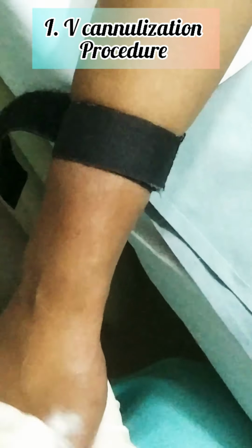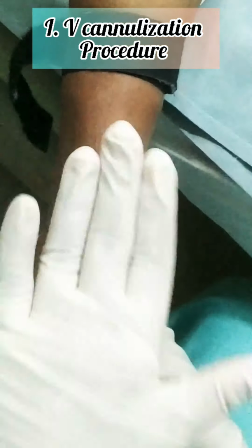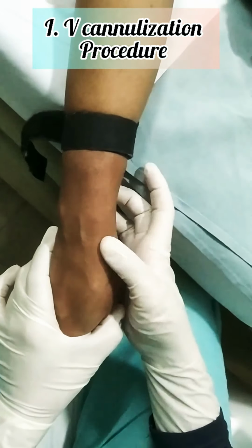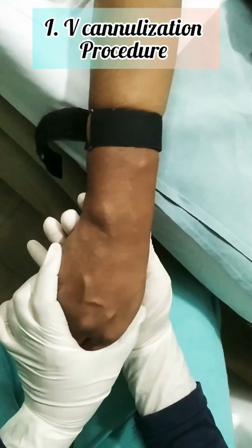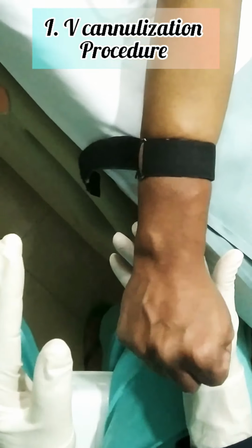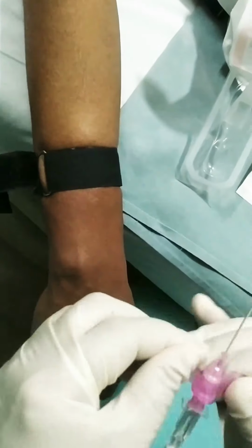In some patients, veins move too much, which makes it difficult to insert the IV cannula in the vein. So the tourniquet will prevent all that. After that we can also use the tapping method to select the area for IV cannulization. Then we have to clean the selected area with an alcohol swab or a soaked isopropyl cotton swab to visualize the area of inserting the cannula.